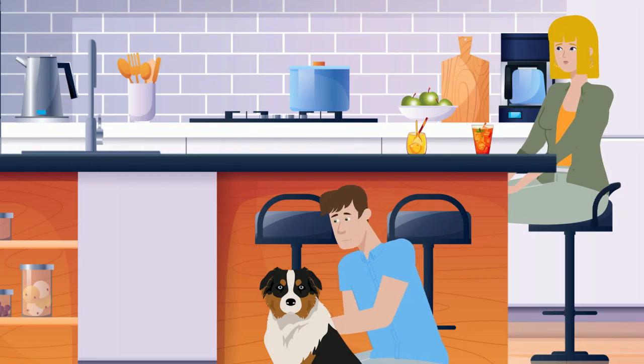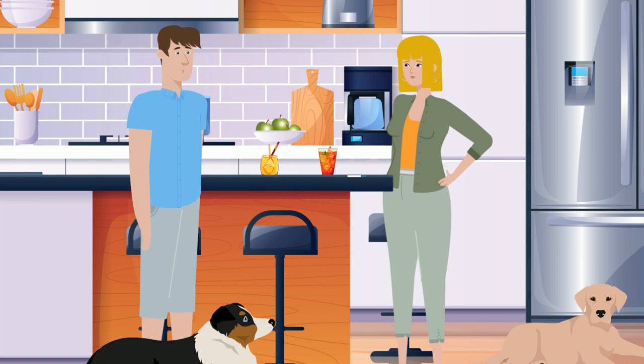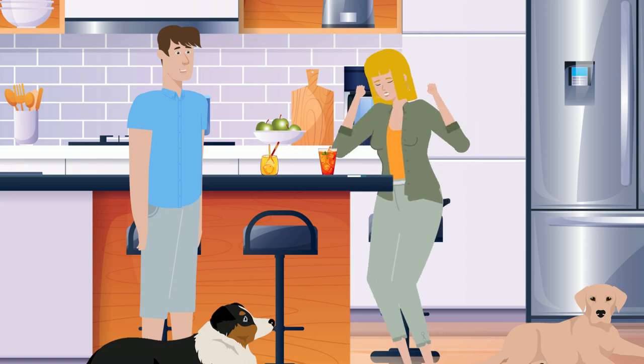Look, Scotty has one. Crazy! I have his ID number, and what's more, his temperature is displayed. In addition, when you first read the identification chip, you automatically recorded your animal's reference temperature. Now the reader tells you if he has a fever or not.